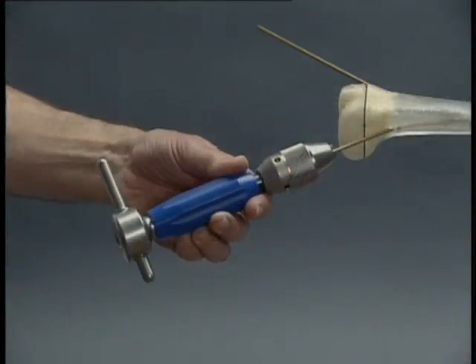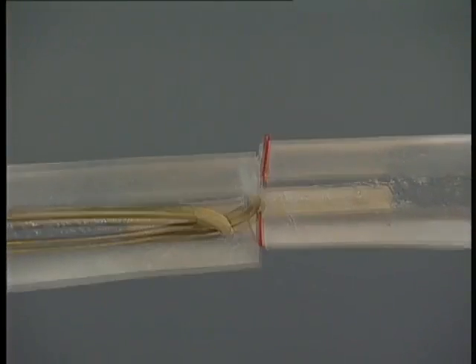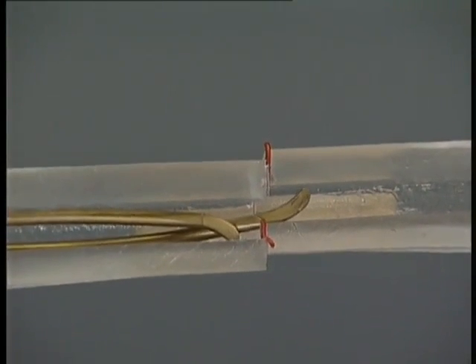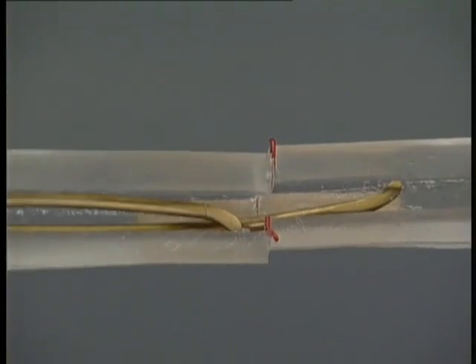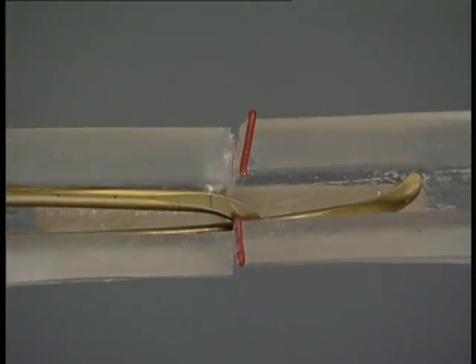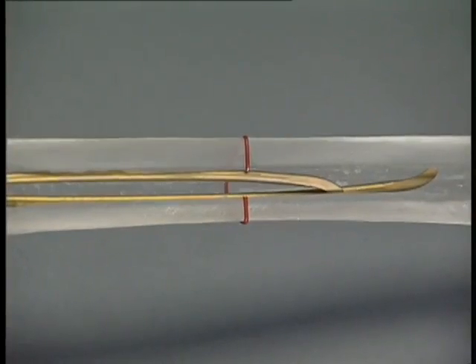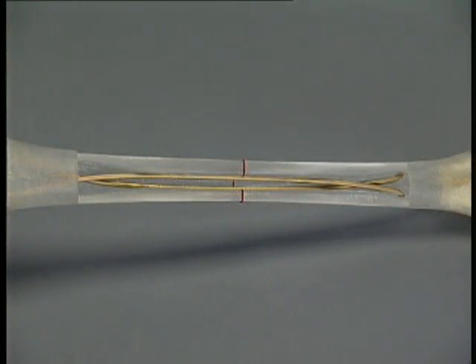When the two medullary cavities are aligned correctly, the nails are advanced alternately across the fracture zone with gentle tapping or rotating movements, far enough for the main fragments to be held securely, so the fracture is definitively reduced indirectly by the nails themselves. The nails are then advanced alternately to just short of the metaphysis, ensuring that the tips are correctly aligned in the frontal plane. Rotation is also checked at this stage, as adjustment will no longer be possible after fixation in the metaphysis.